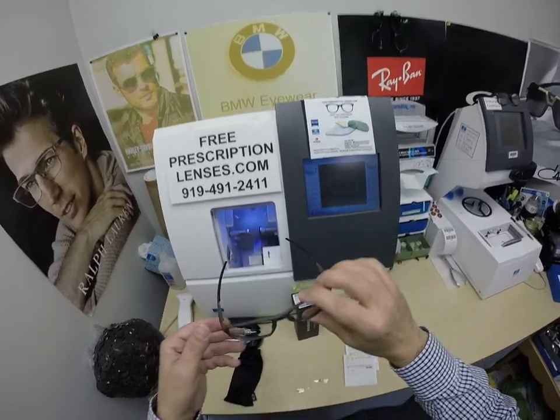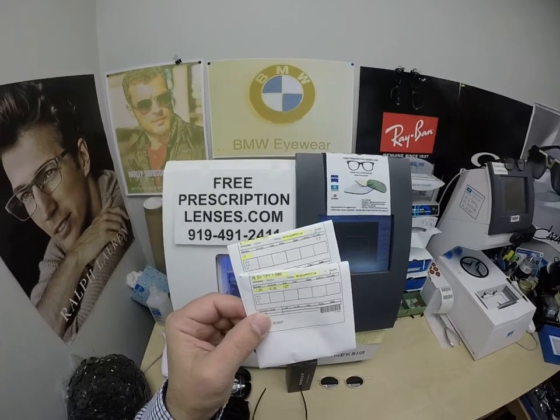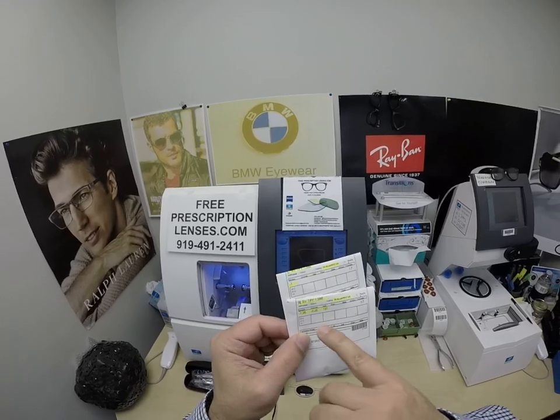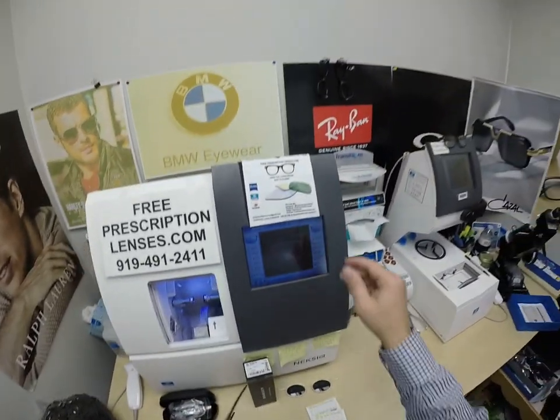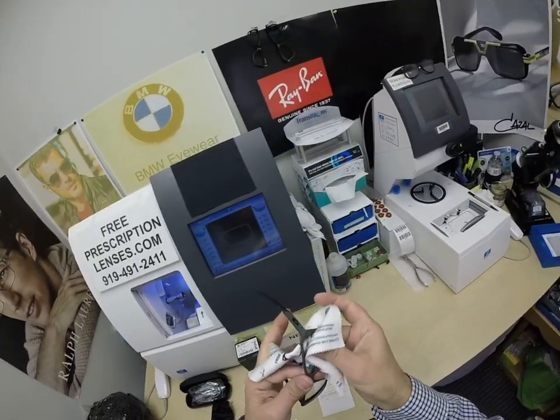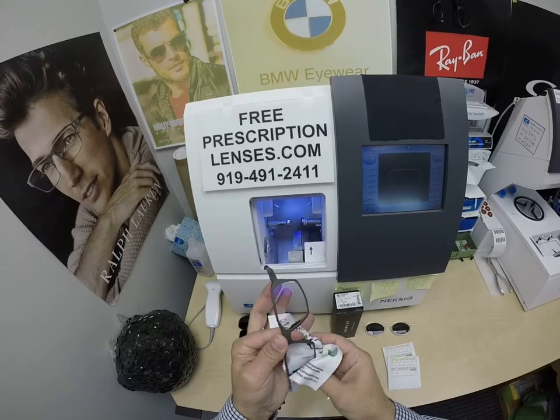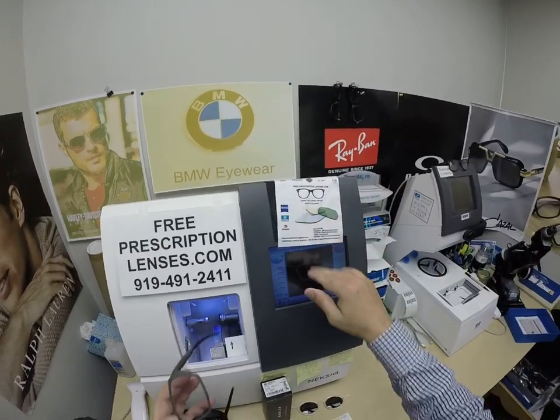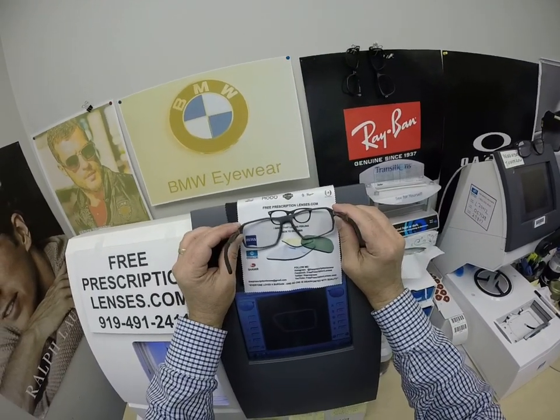Cornell got these with the Zeiss Transitions Extra Active Polarized Gray with Zeiss DuraVision Blue Protect. I've highlighted prescription for the right eye, same for the left. Let me clean these up and we're going to get these bad boys activated — meaning I'm exposing them to a strong burst of ultraviolet light. I'm just amazed — look how clear these Zeiss Transitions Extra Active Polarized are indoors.